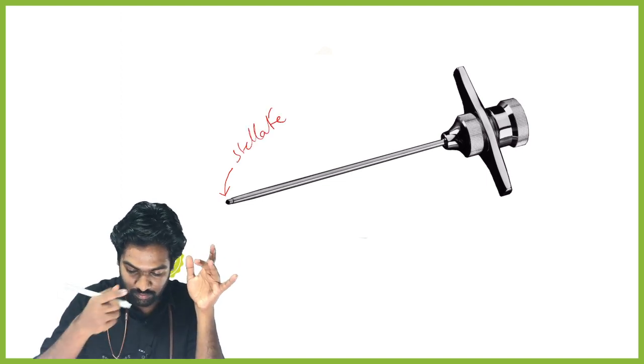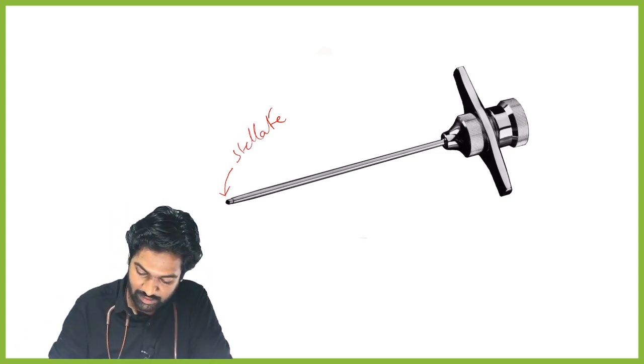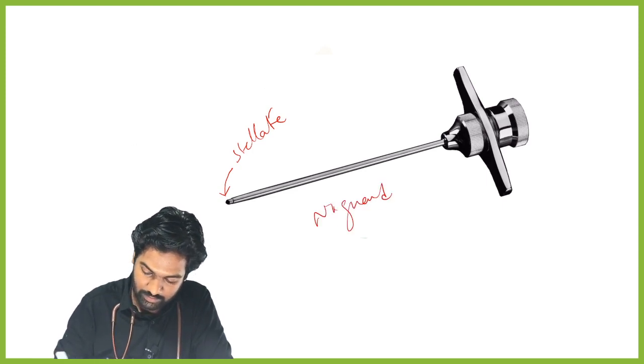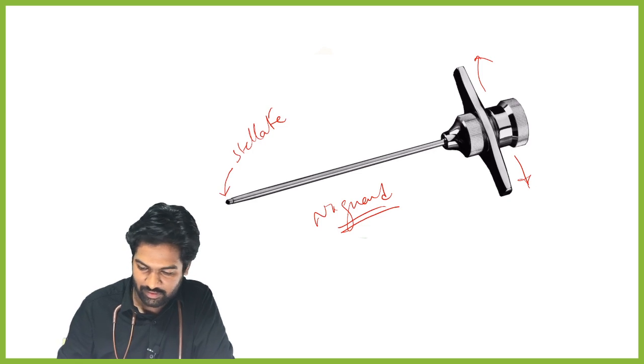What is the site here? Posterior superior iliac spine. Okay, know that. And this is Jamshidi's needle. See, no guard, nothing. The entire thing is a little wider like this. The moment you see it, you must be able to identify it.